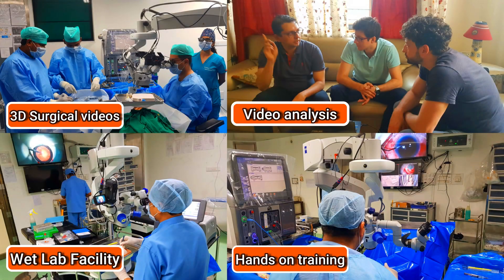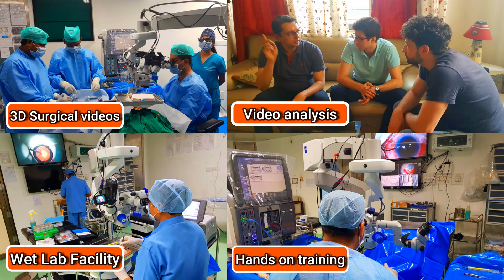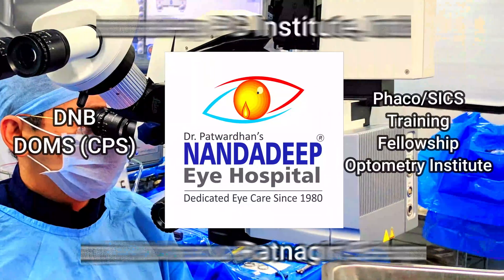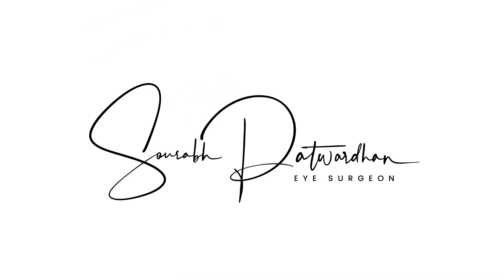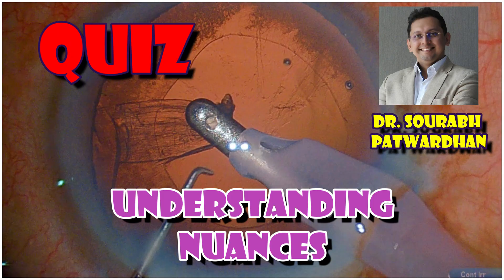In our center, we have a lot of teaching activities which includes hands-on training as well. This video is like a quiz where I want you all to watch this surgical case very carefully to understand the nuances.